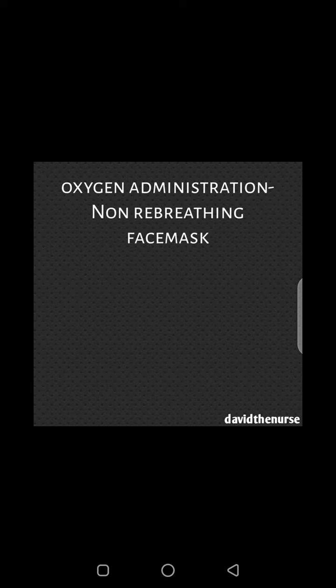So when the patient exhales carbon dioxide, we want to minimize or avoid the patient from rebreathing the same CO2 that was exhaled. So that is why we call it non-rebreathing face mask.